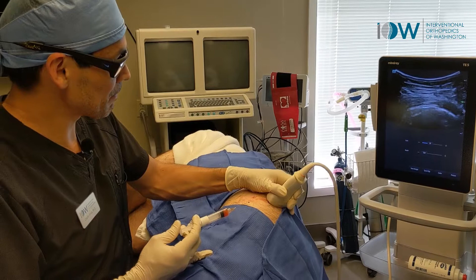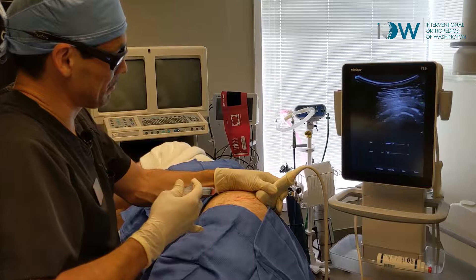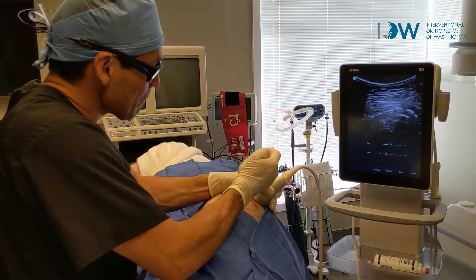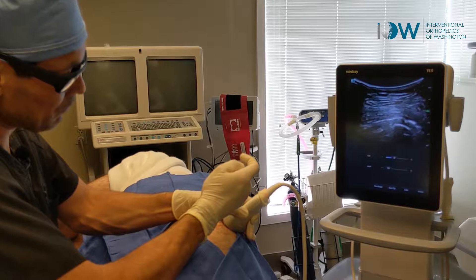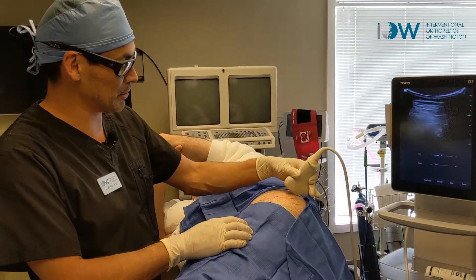Now posteriorly, we've got glute max coming right along there. There's some light fenestrations. And that concludes the glute min, glute med, glute max PRP injections with barbotage and lavage at the enthesophytes of glute medius.